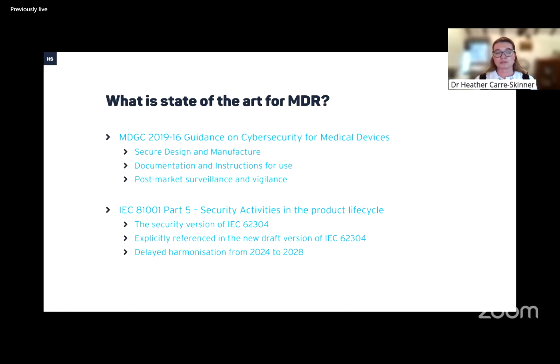However, there is also another standard, IEC 81001 Part 5, which is very robust, and it outlines security activities in the product lifecycle. So this is essentially the security version of IEC 62304.